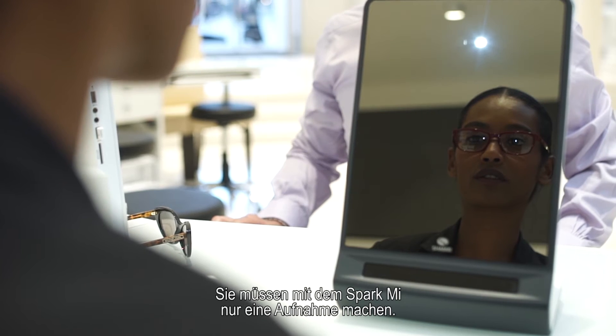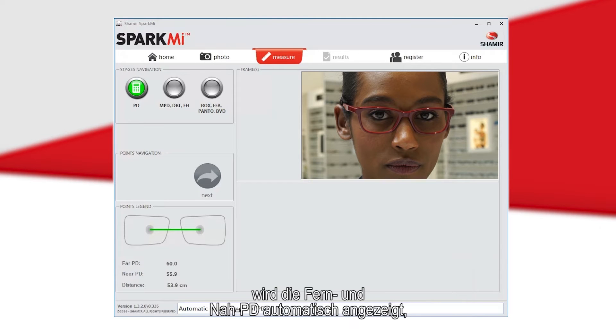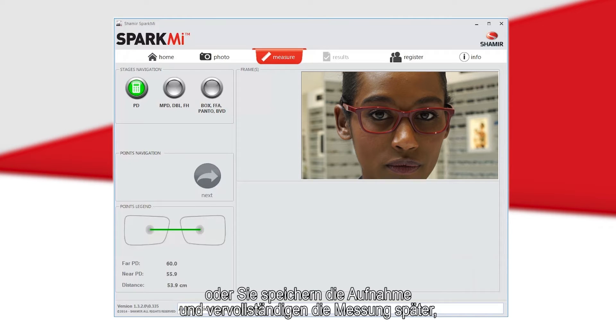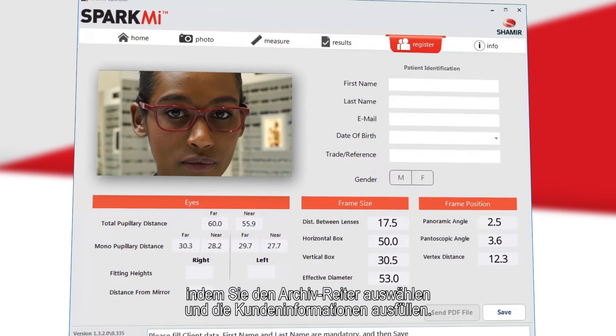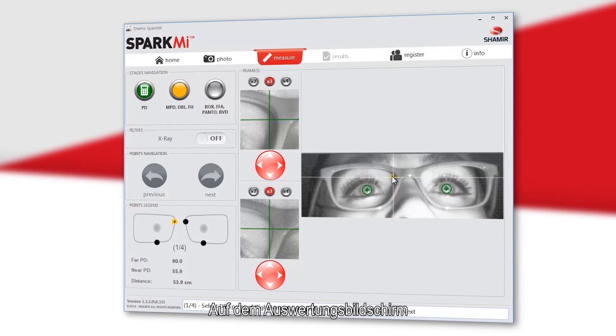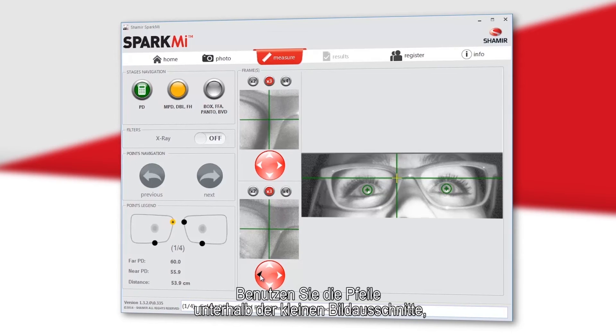There is only one picture to take with the SparkMe. Once the picture has been successfully taken, the far and near PD will automatically appear on the bottom left side of your screen. You may then proceed to the measurement screen, or save the photo and complete the patient's measurements later by hitting the Register tab and filling in the patient's information.